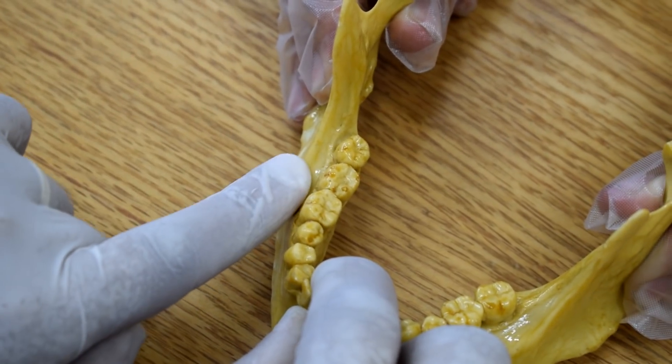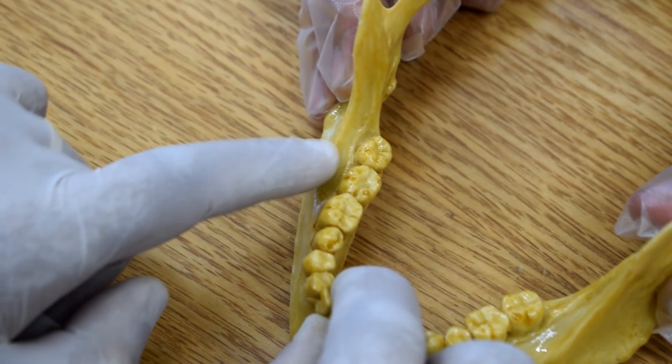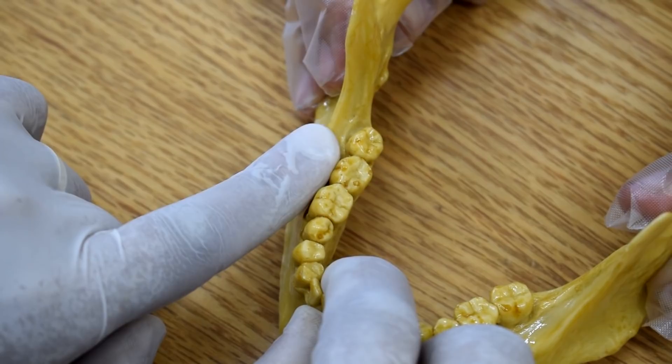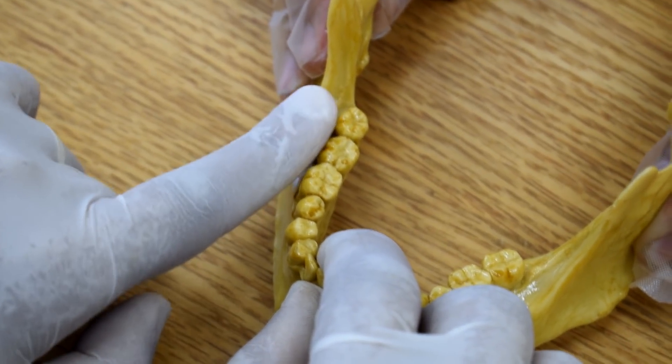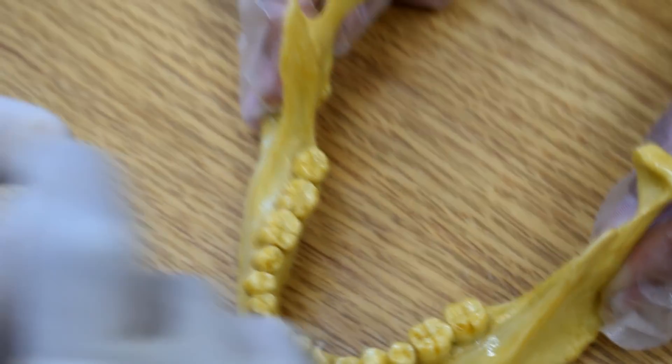Now, while I'm proceeding posteriorly, I will move to the beginning of the external oblique ridge. At this point, I will trace it posteriorly and superiorly. I find myself going upwards and forward. At this point, I will feel the external oblique ridge under the midpoint of my finger bed.